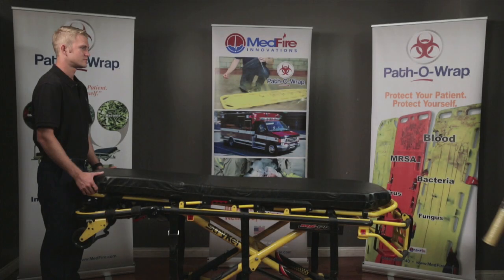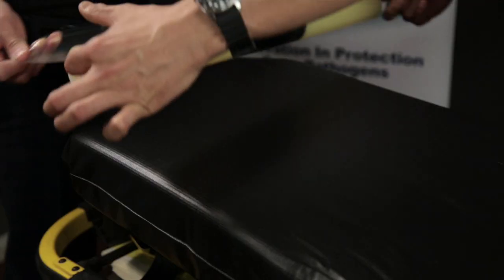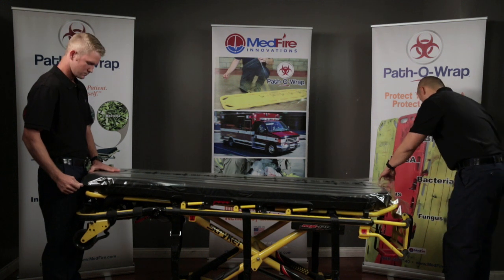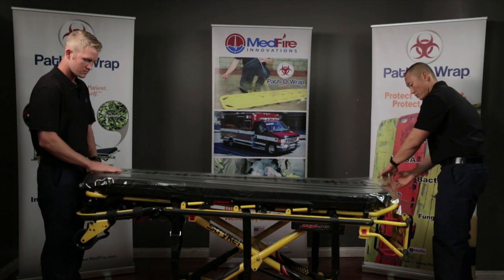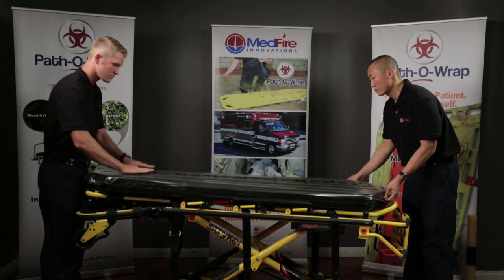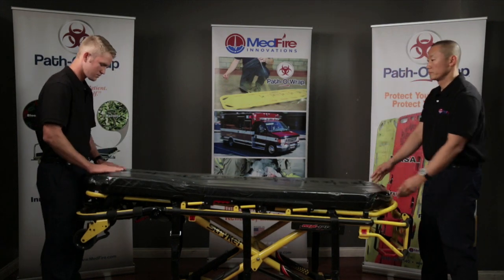PathoWrap is easy to apply to a gurney mattress. Pull from the leading perforated edge from a 20-count roll of PathoWrap. Place the leading edge of the PathoWrap sheet on one end of the ambulance gurney mattress — the head or the foot, your preference. Pull the PathoWrap roll towards the opposite end of the gurney mattress while simultaneously laying the PathoWrap on top of the mattress. Smooth the PathoWrap sheet on top and around the edges of the mattress to secure, and the application is complete.